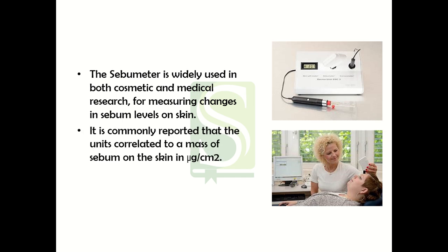So there are various methods by which you can determine this sebum. Like you can go for swabbing by pads which are earlier soaked in organic solvents like hexane or ether, or washing lipid solvents over areas of skin which are then circumscribed by rings or caps. There are n number of methods. Out of these methods, a Sebumeter is very widely used for both cosmetic and medical research.